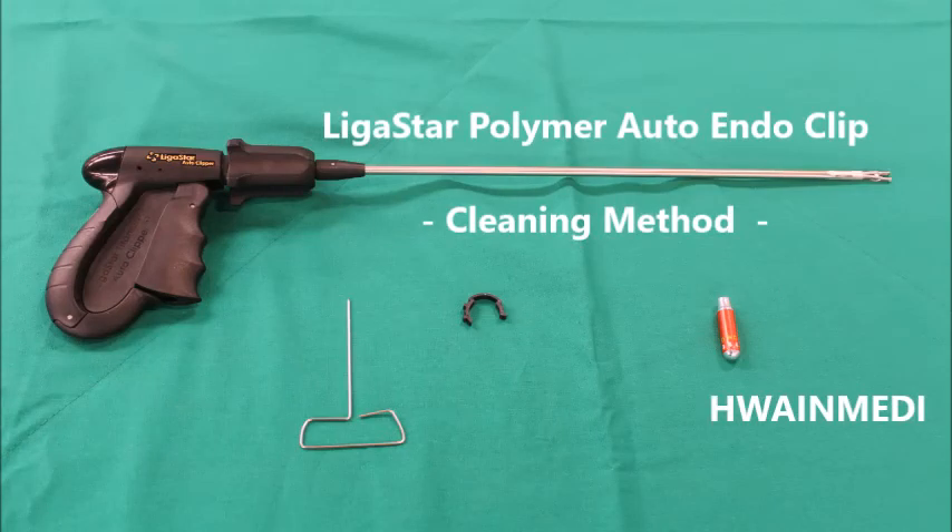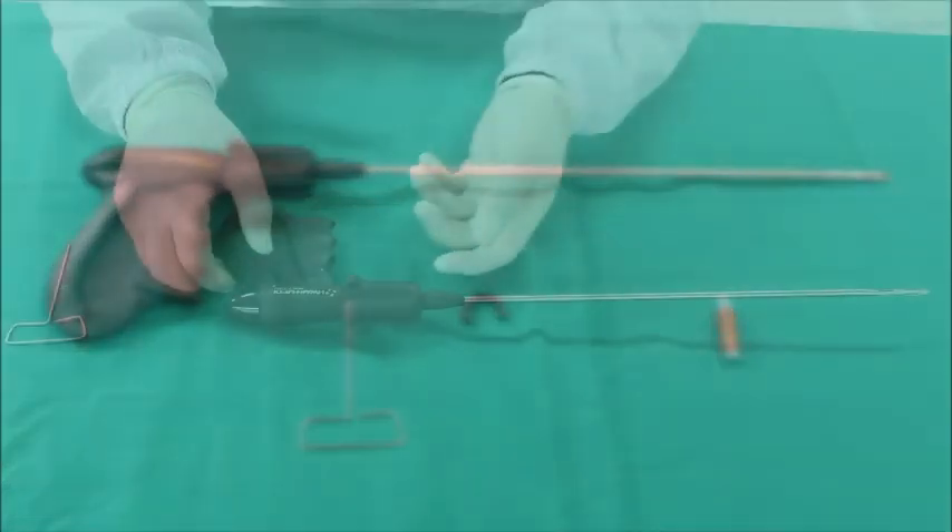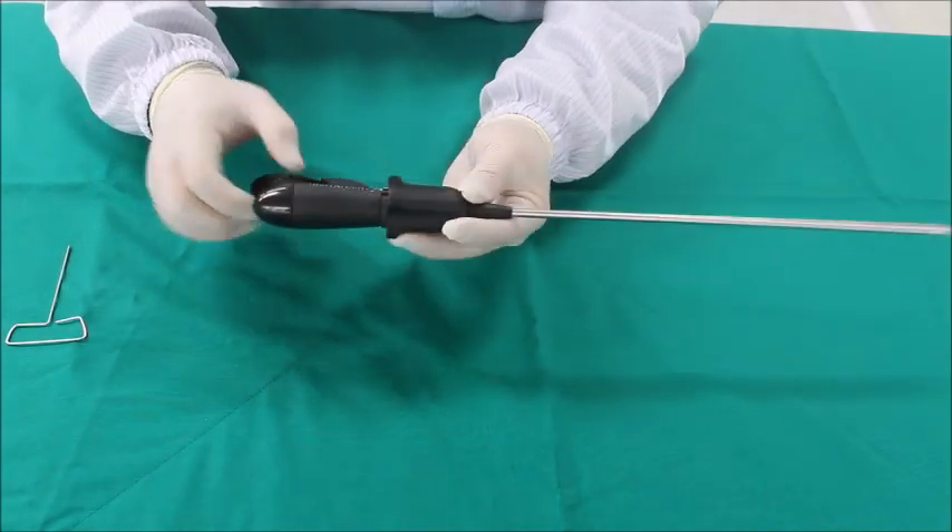This video describes how to clean the Ligista polymer clip, which requires cleaning.